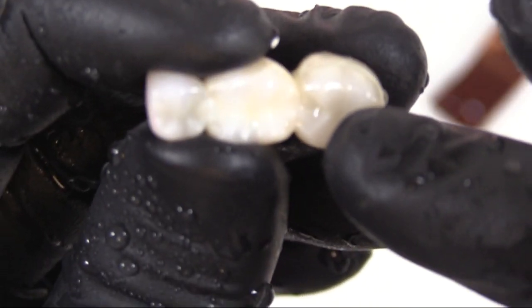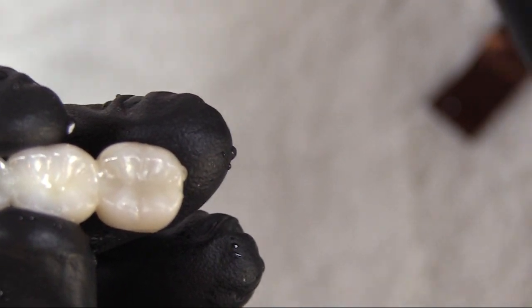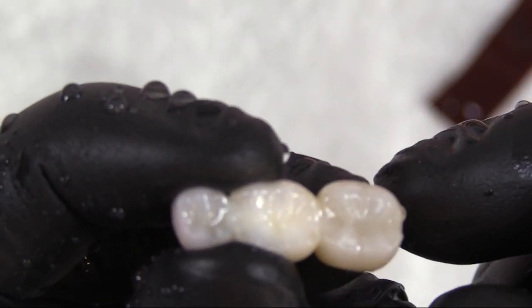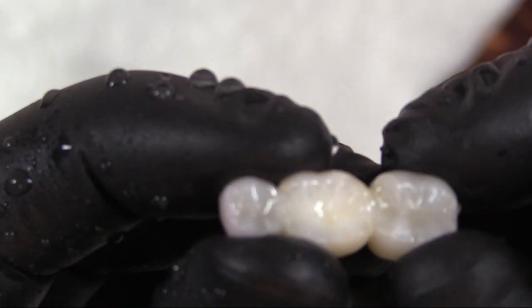That's how you would adjust the interproximal. Once it's fully seated, you'll do the same thing with the acufilm along the occlusal. Whatever your occlusal scheme is, you would adjust accordingly, and most likely not have to use the blue ones and just solely use the green medium grit followed by the orange fine grit.